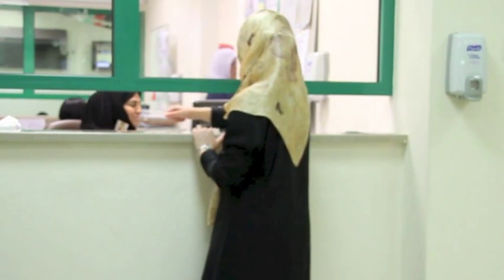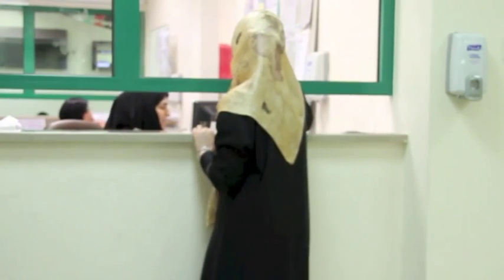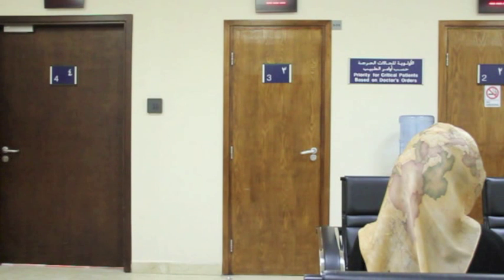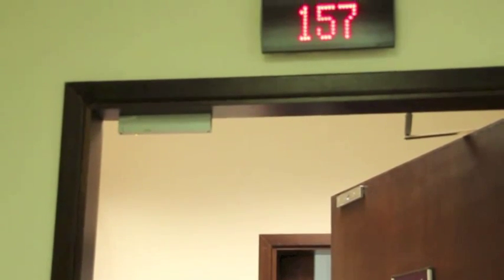You will be given a waiting queue number and will be instructed to take a seat and wait for your number to be called by the phlebotomist. As soon as the phlebotomy procedure on the previous patient has been completed and the blood draw cubicle has been prepared, your number will be called.